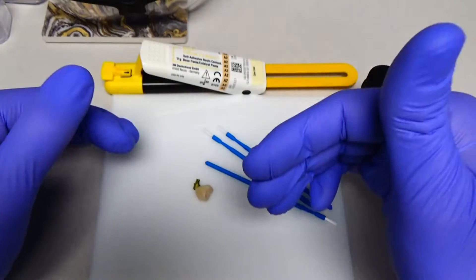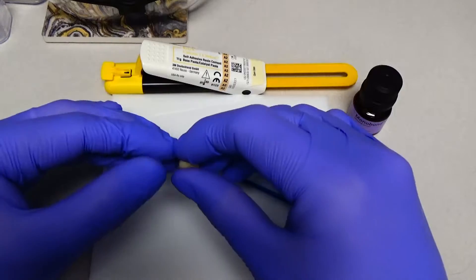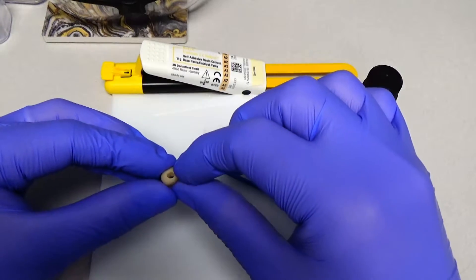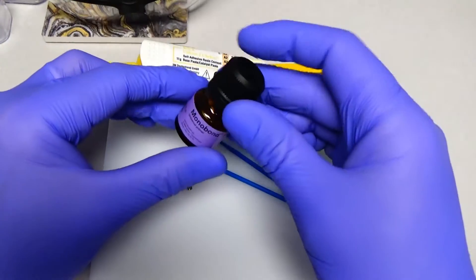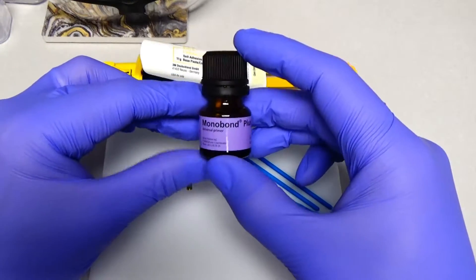Now, if you're doing this with lithium disilicate, you would want to do acid etching on the internal portion here. Now, the next thing to keep in mind is we need to prime.